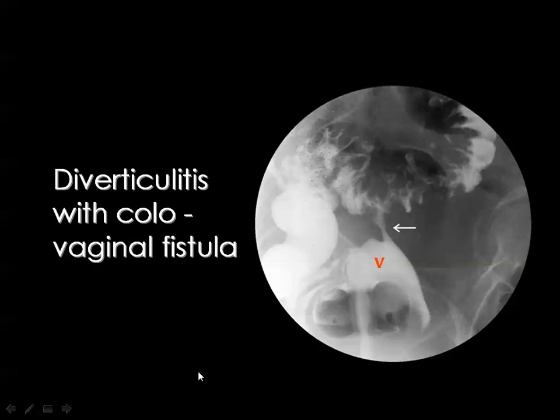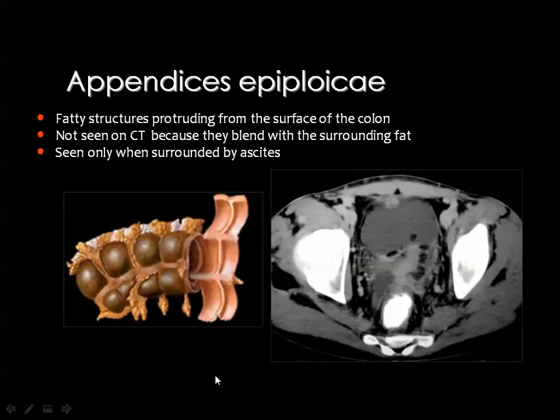And one of the common findings that are usually presented in the exams is that you see a patient with colonic diverticulosis and air inside the urinary bladder. Then you know that this air is coming from the colon as a sequela of a vesicocolonic fistula, and this is usually the diagnosis.